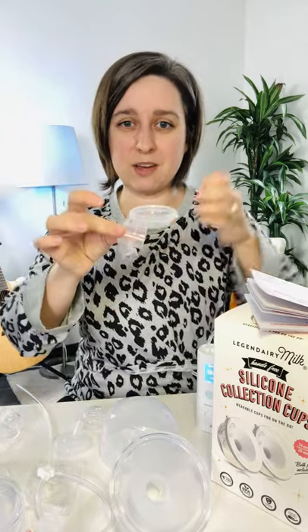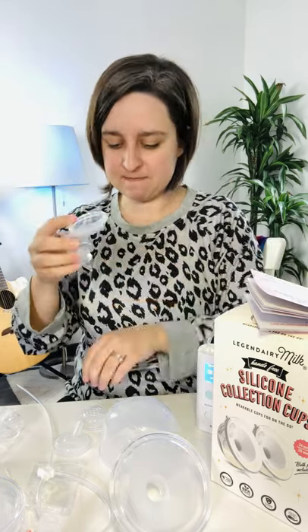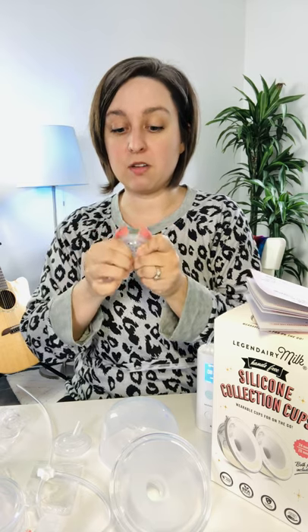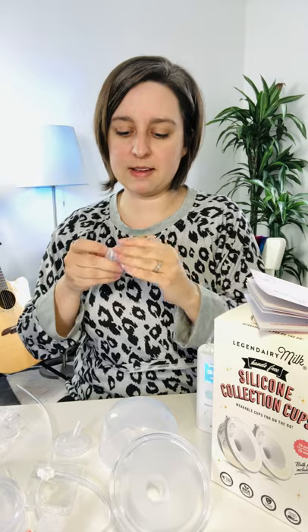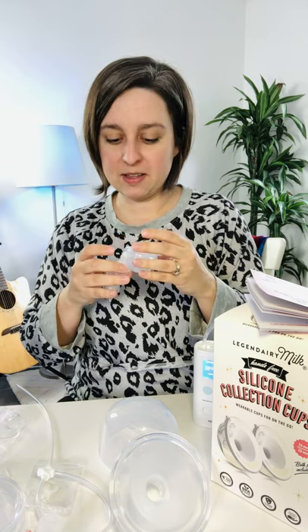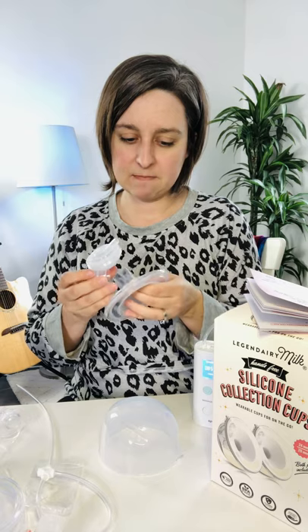Assembly is very similar to other cups. It's all one piece here. A little duckbill valve goes on the bottom. This is a little backflow protector — it's the suction part that keeps milk in the cup from going up the tube. That's the whole point of a closed system pump: there's a barrier between the milk and the tubing and motor. This has a little arrow to help you line it up.